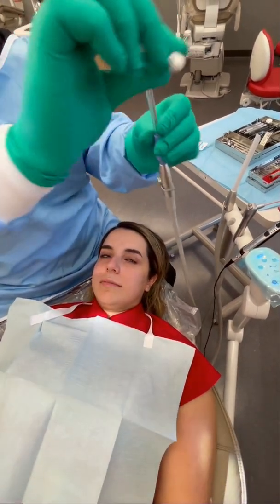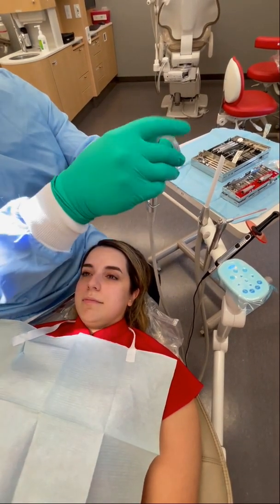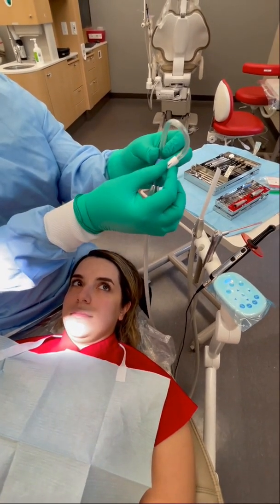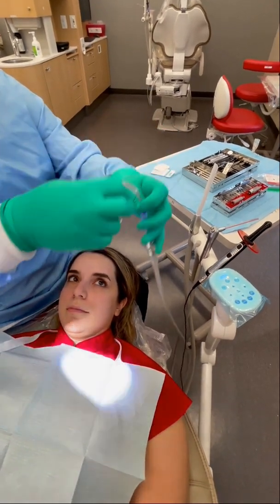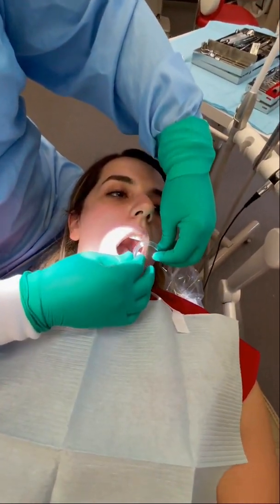The first thing you do: fold it in half, give it a curl. Then you're going to take this end and give it a little bend, so it looks kind of like a chair. Then have your patient turn their head towards the side that you're working on and just hang it. You never have to touch that again.